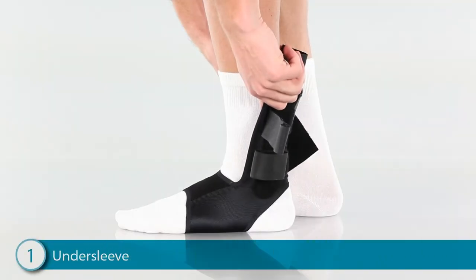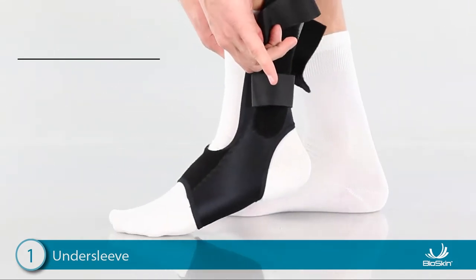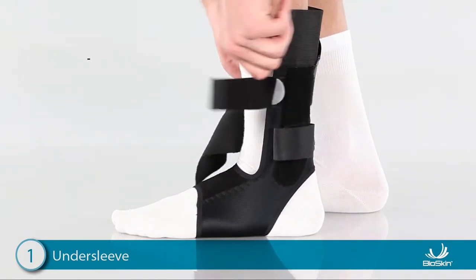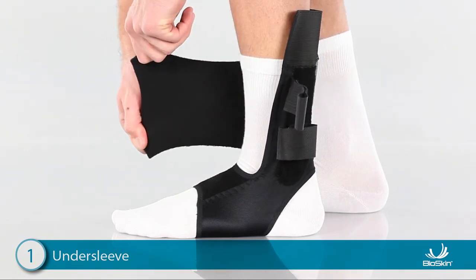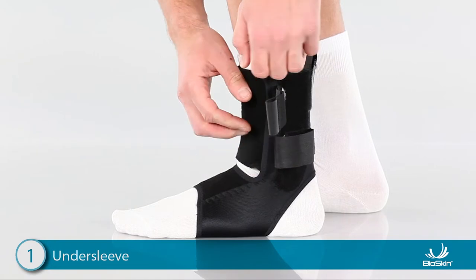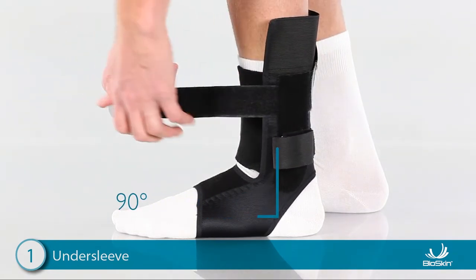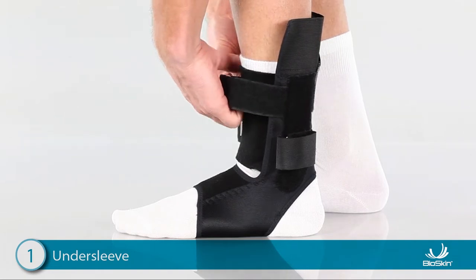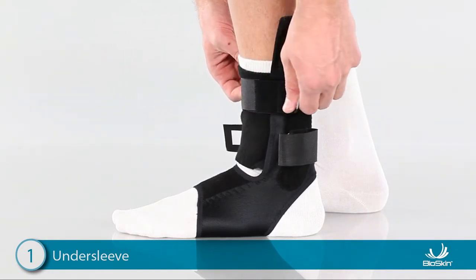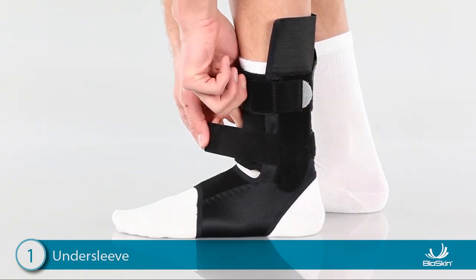Step 1: applying the undersleeve. Pull the undersleeve over the foot with or without a sock and pull up tight. Next, locate the fleece flap, wrap it around the ankle, and tuck it into the brace. To close the undersleeve, position the foot at a 90-degree angle, then pull the top strap through the D-ring, cinch snug, and attach. It is important that this strap is comfortably tight. Then pull the lower strap around the ankle and attach.